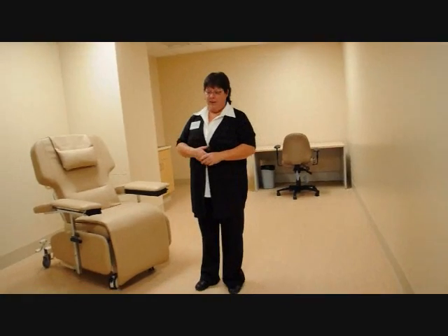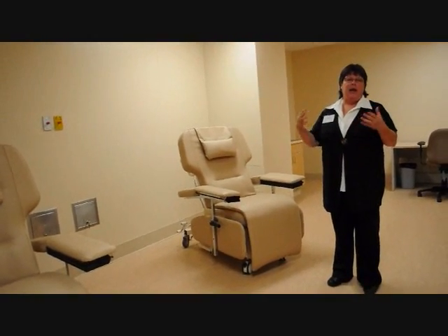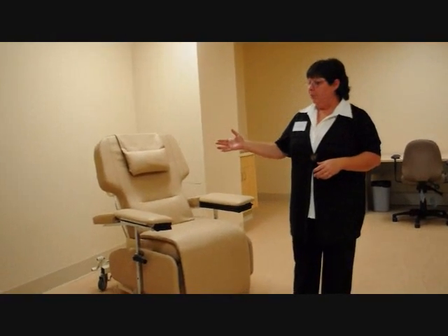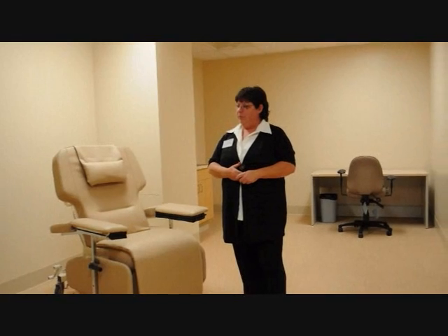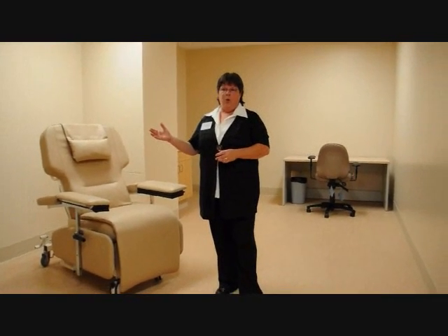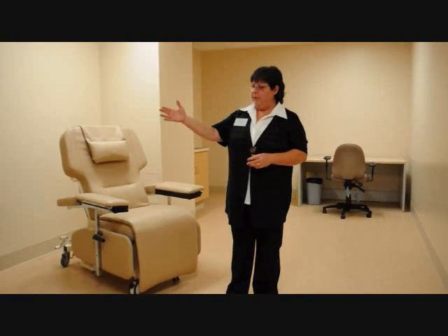The home dialysis program, we run two programs, peritoneal dialysis and hemodialysis. And this room is the training room for home hemodialysis. Many of our patients do home nocturnal, so that's long, slow dialysis. The training is a little more intense. It's a 6-week training program.